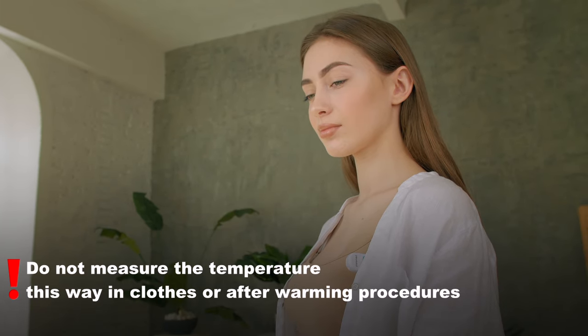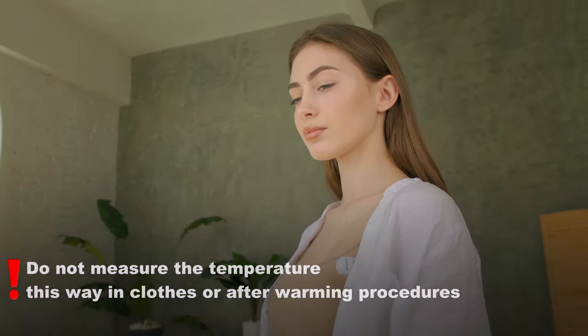Do not measure temperature this way while you are dressed or after a bath or a hot drink.